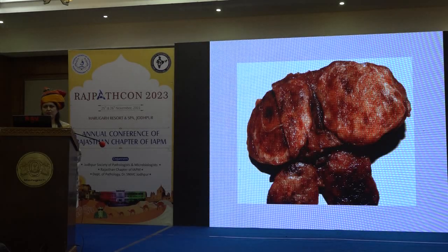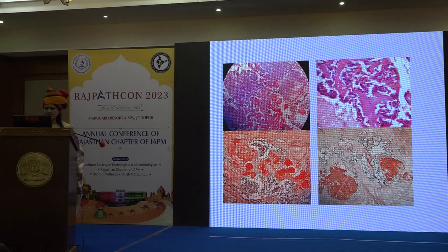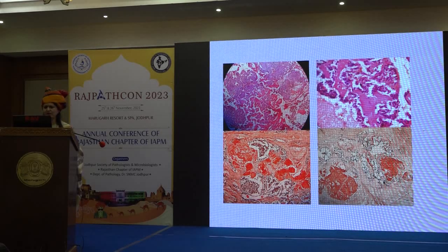Grossly, most of the time they are sporadic, as well as familial as part of the MEN syndrome. These tumors are huge and on gross morphology they show a mahogany brown color many times. These are specimens from my collection, and you can see the tumor cells are separated by eosinophilic material. These tumor cells are small, at times they show eccentric nuclei. The top figures are H&E sections, whereas the photographs on the lower side show the Congo red stain showing the amyloid material beautifully.